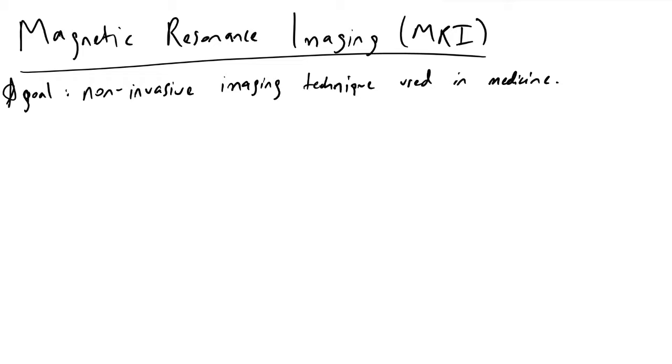how doctors respond appropriately. And so in this video, what I'm going to do is cover how, in practice, these MRI machines are actually working, and it's all based off something we've discussed previously, which is NMR, nuclear magnetic resonance. And for PR purposes, they drop the nuclear term, but it relies on the exact same principles.